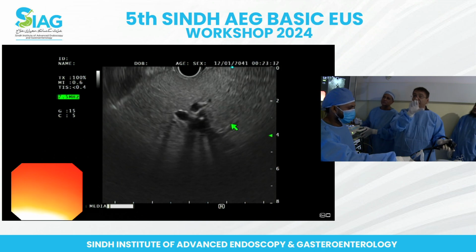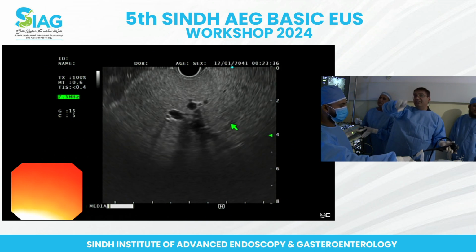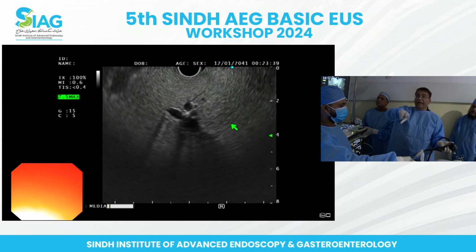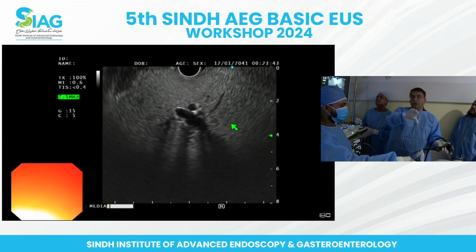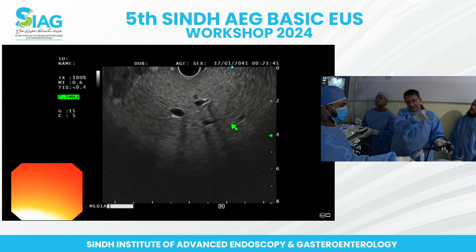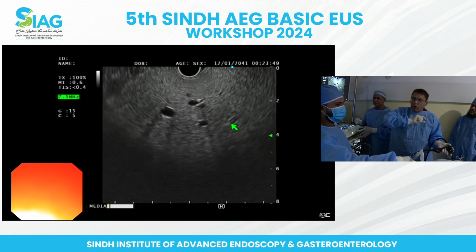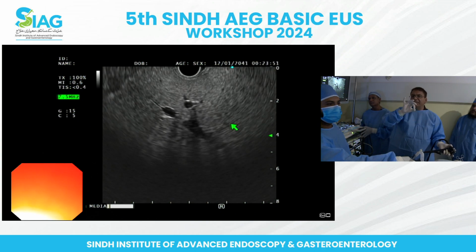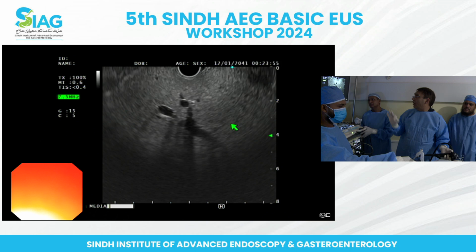Actually, 70% of the time they enter into the IVC at the same place, and they connect together before they enter. So that sometimes could be confusing as well. And then different branches go around. But the mid-hepatic vein throughout the course is the same diameter. So that's the way to figure that out.